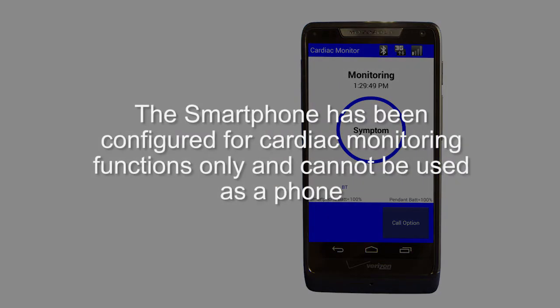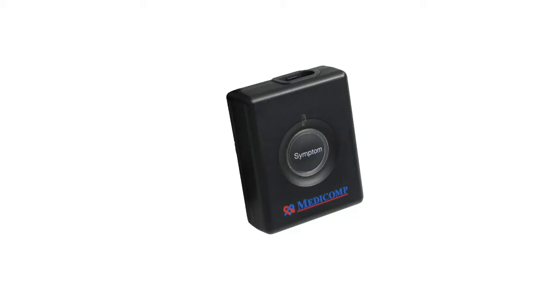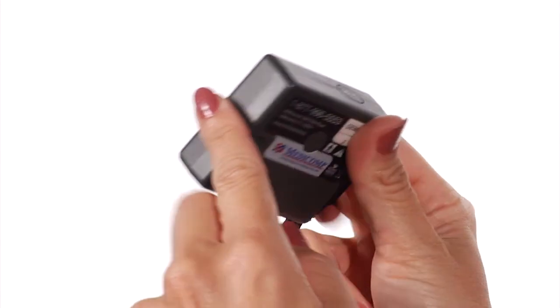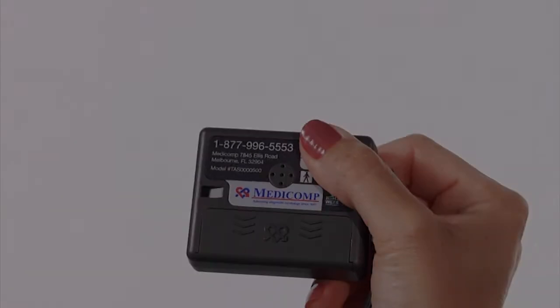The smartphone has been configured for cardiac monitoring functions only and cannot be used as a phone. Now let's become familiar with the Pendant. The Pendant has an on-off button, the symptom button, patient cable connector, and lanyard hook. On the back, you'll find the battery compartment and the toll-free number to the Medicomp cardiac monitoring center.